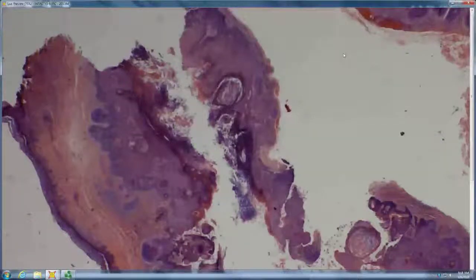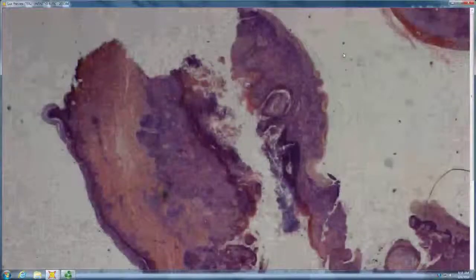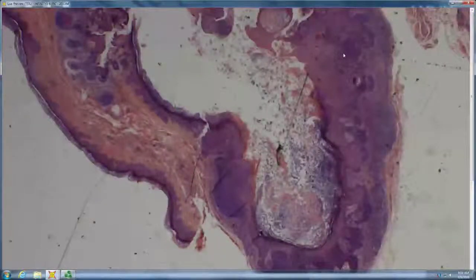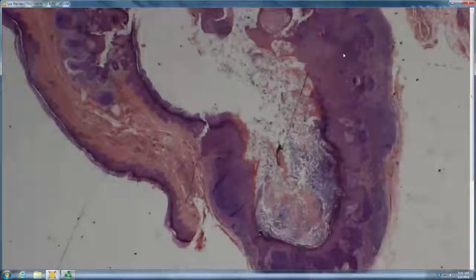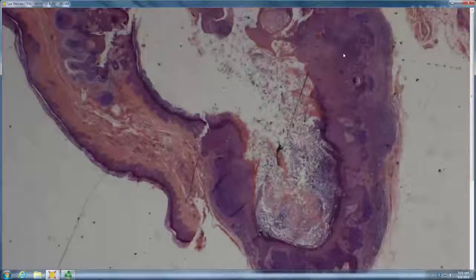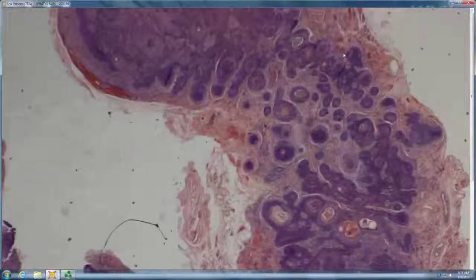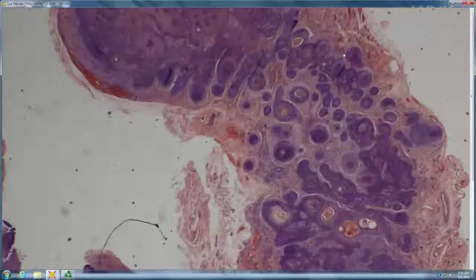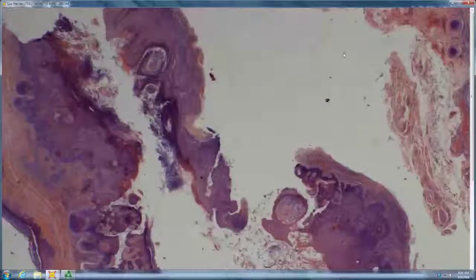So either a big trichofolliculoma, or this could be a cystic panfolliculoma if you see other areas of differentiation. You clearly have trichohyalin granules, but you're not really making hair fibers going into this particular one. Some areas where it's getting close. So either a big cystic trichofolliculoma or a cystic panfolliculoma would be best designations for that one.